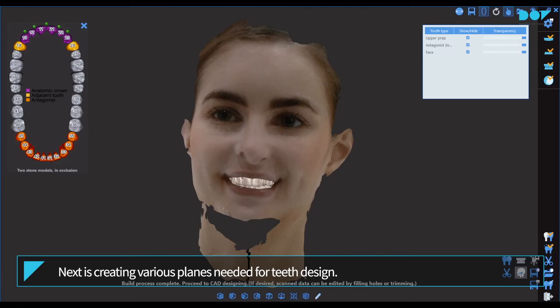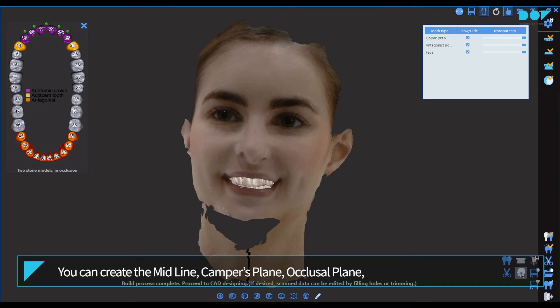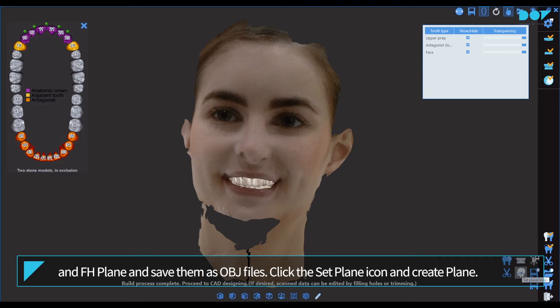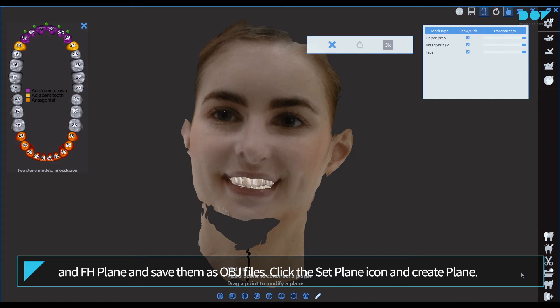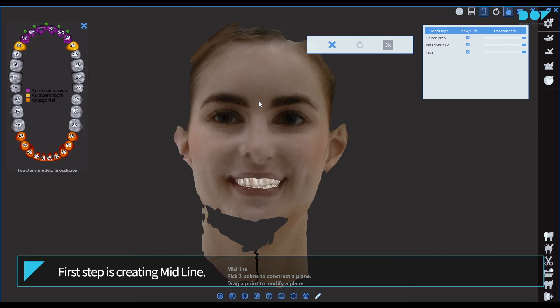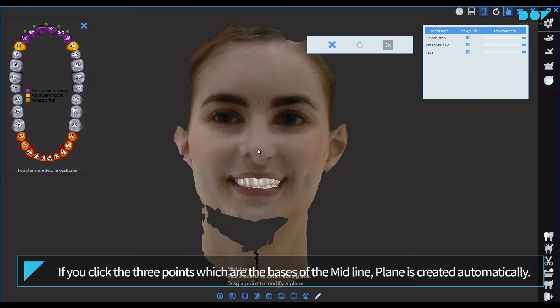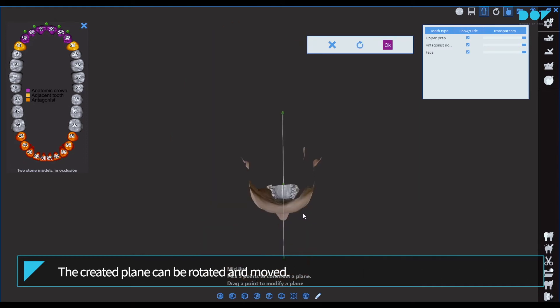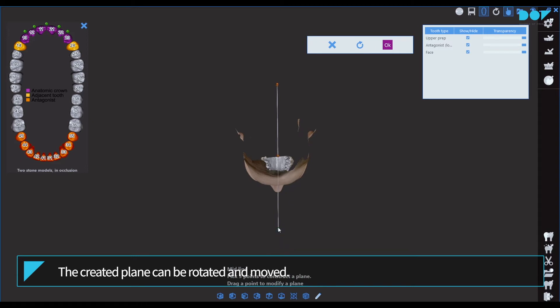Next is creating various planes needed for teeth design. You can create the midline, Camper's plane, occlusal plane, and FH plane, and save them as OBJ files. Click the 'Set Plane' icon and create plane. The first step is creating the midline. If you click the three points which are the bases of the midline, the plane is created automatically.